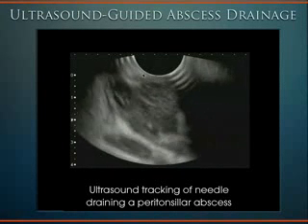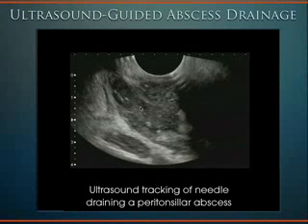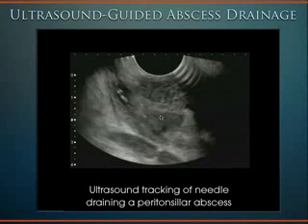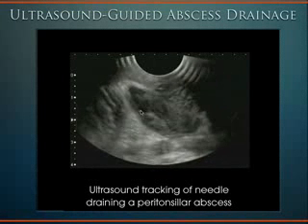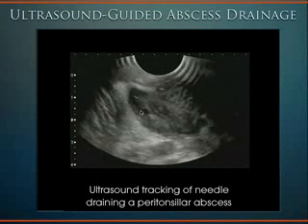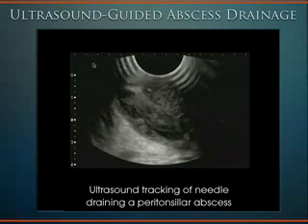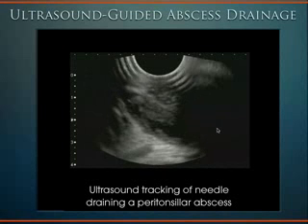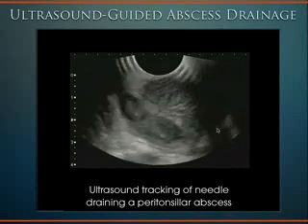It's just from the posterior oropharynx, this mucosal line right here, all the way down to where this abscess material is. Some of these large abscesses are actually quite easy to drain, although sometimes they're so extensive, involving a really large area back here, that you may not want to attempt drainage yourself in the clinic or even the emergency department setting.